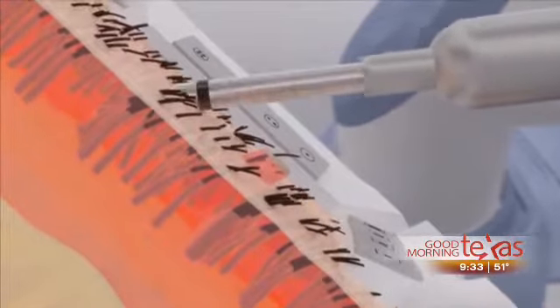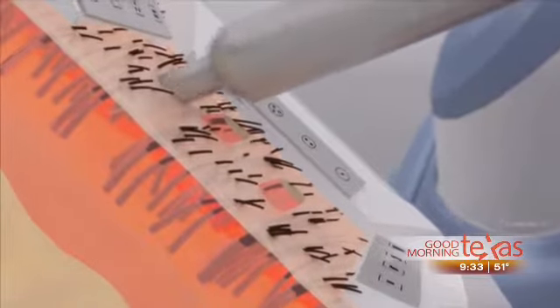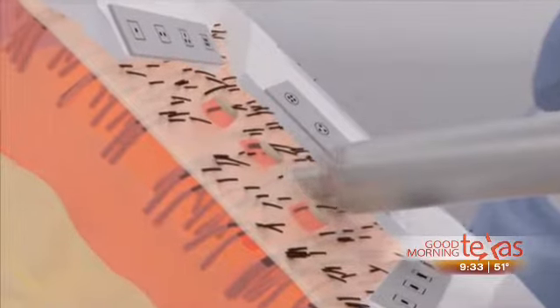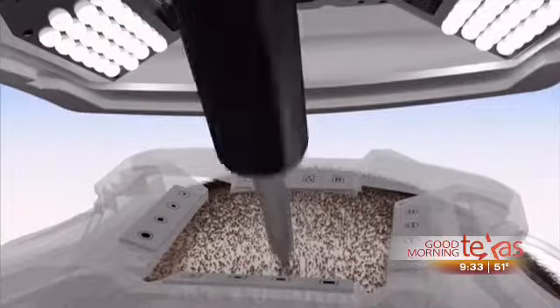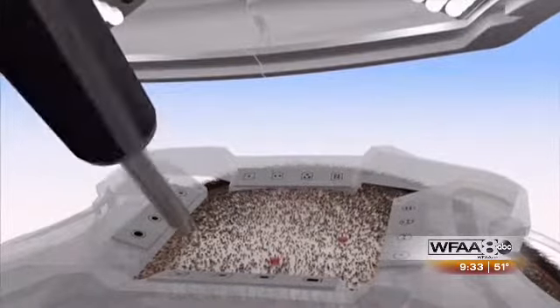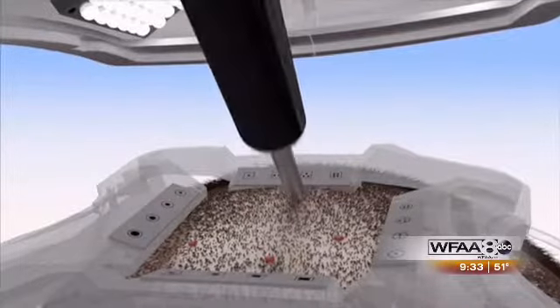How is this transplant different than maybe some others that are out there in the industry? Sure. Well, the conventional transplants of old, what's been going on for about 30 years, is where people would take a strip of scalp out of the back and close that up with a linear scar. You would use either a suture or a stapling technique, and that would require some specific downtime, typically about 2 or sometimes even up to 3 weeks.